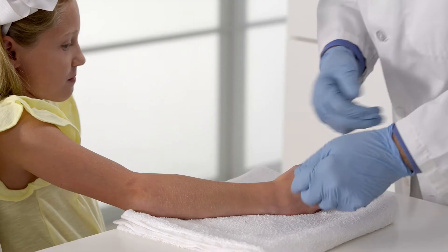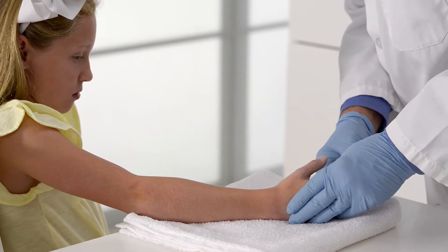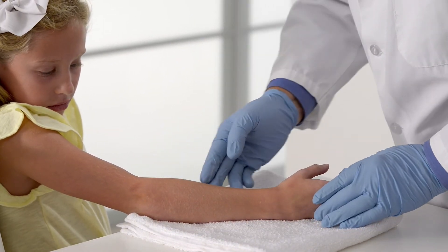When finished, the cast will extend from the tip of the thumb and the distal palmar crease to two finger widths below where the arm bends at the elbow. This allows the patient to bend the fingers, hand, and elbow comfortably.